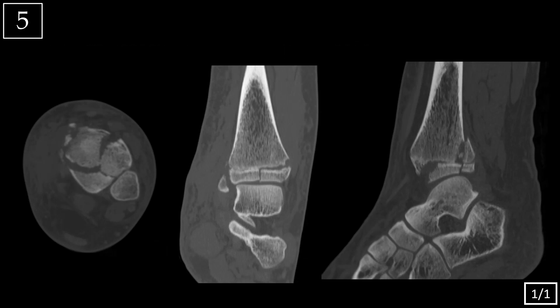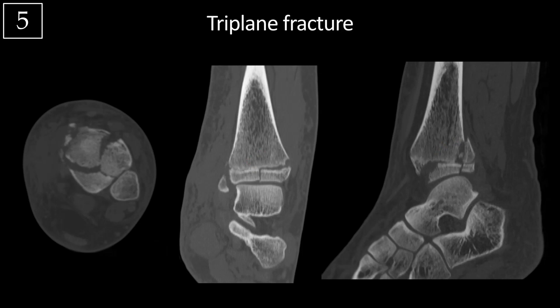Final case. Here we're looking at a CT scan of the ankle in a pediatric patient — you can tell because the growth plates are not entirely fused. The fracture we're seeing is a triplane fracture, which only occurs in adolescence because the growth plate starts to fuse medially, leaving the lateral aspect open and prone to this type of fracture. You can think of this as a type 4 Salter-Harris fracture: it's composed of a vertical fracture through the epiphysis, a horizontal fracture through the growth plate, and an oblique fracture through the metaphysis visible on the sagittal reformatted image.